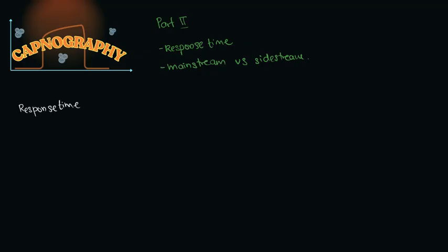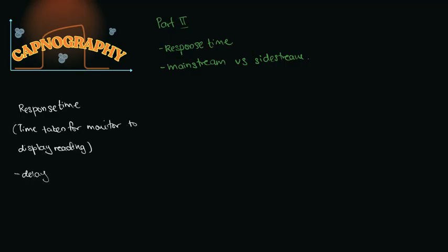Okay, so what is response time? Response time is the time taken for the monitor to display the readings. Capnography has a delay because carbon dioxide needs to travel from the patient's airway all the way through the sampling tube to the analyzer, and once it is at the analyzer, it needs some time to respond and to compute before being able to show the graph as a display. This is particularly more significant in sidestream analysis.